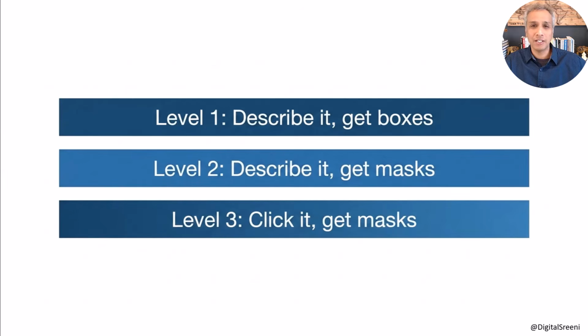If your image has thousands of these glomeruli, maybe this automated process picks up, let's say, 80% of your glomeruli, and for the remaining 20%, you need to have tools to make it easy, and that's where SAM comes into the picture. Click, click, click, click, and then you label your glomeruli right there.